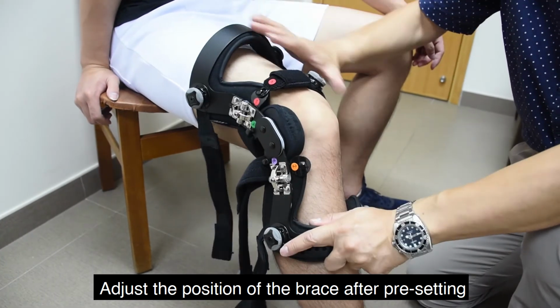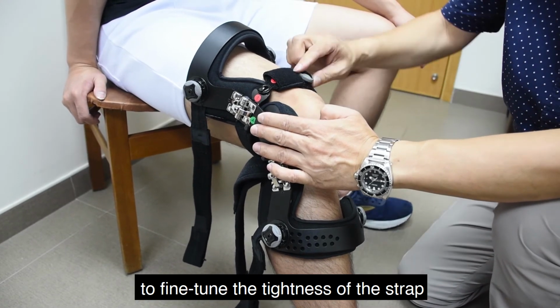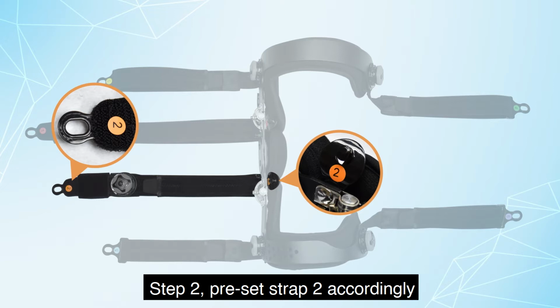Adjust the position of the brace after presetting. Hold the hinge with one hand. Press and turn the cinch device to fine-tune the tightness of the strap. Strap 1 must be tightened snug enough to prevent slippage or migration. Step 2. Preset strap 2 accordingly.